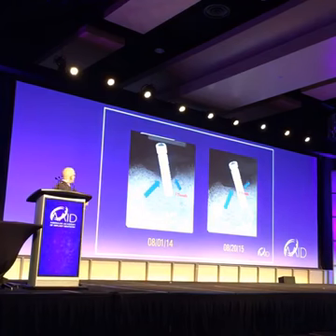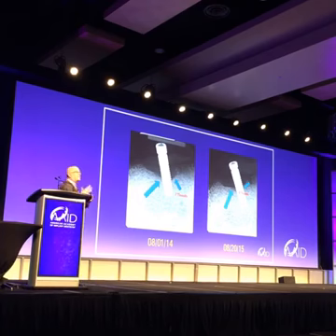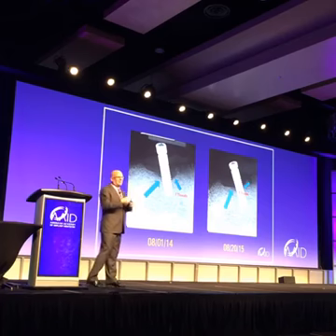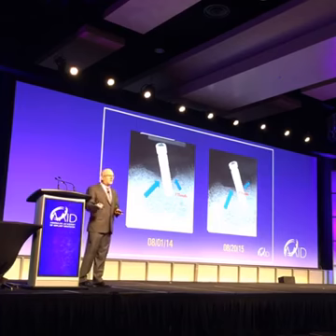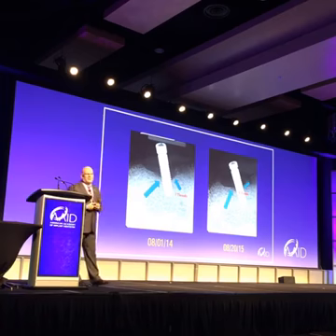But what was interesting was I took an x-ray about a year later, and look, what I didn't expect was I had 7 threads showing on the mesial end of the implant, and now I've got 3 threads of bone come up. Without doing anything other than getting rid of the bacteria, giving the body a chance to heal itself. I'm not trying to sound holistic, it just does what it does. Get rid of the infection, the body heals itself, just like an endo lesion. Get rid of the infection, clean it up, seal it, and that periapical radiolucency grows bone again and grows a PDL again. So that's that.